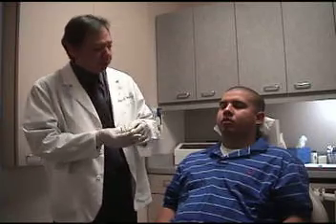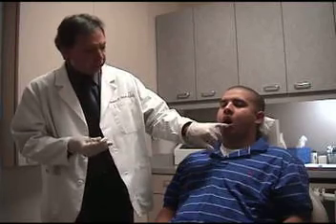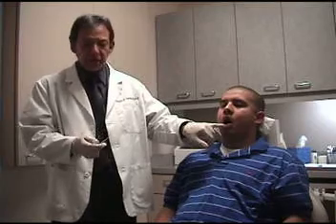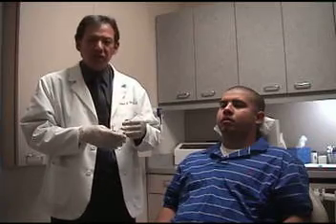Using a flat appliance of any type, Lucia Jig, using Best Bite, any of these flat surfaces, even an NTI, will create an artificial cant based on whatever angulation of the incisal edges that that flat surface comes in contact with. However, a round object, no matter what the cant relationship of the teeth is, will hit at point contacts and be able to capture that without distorting it or creating something that's artificial.